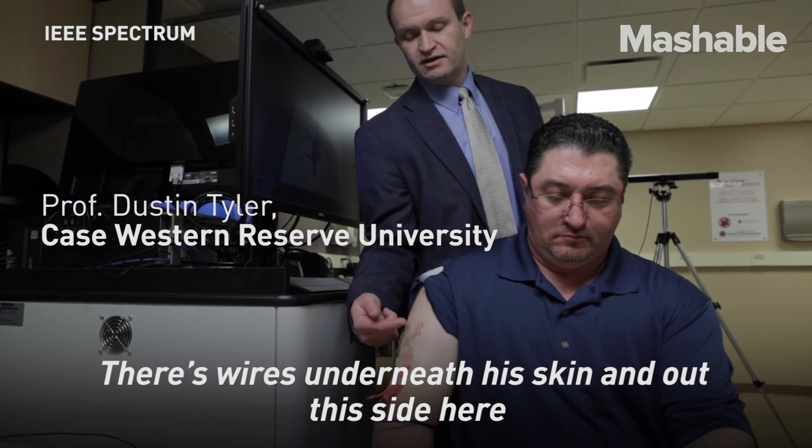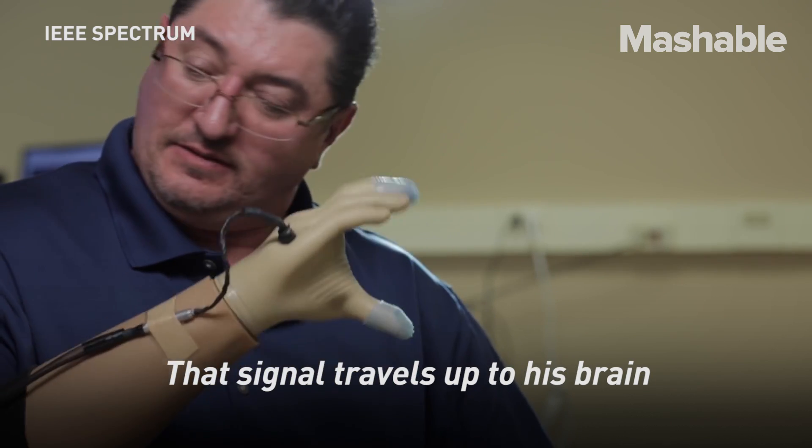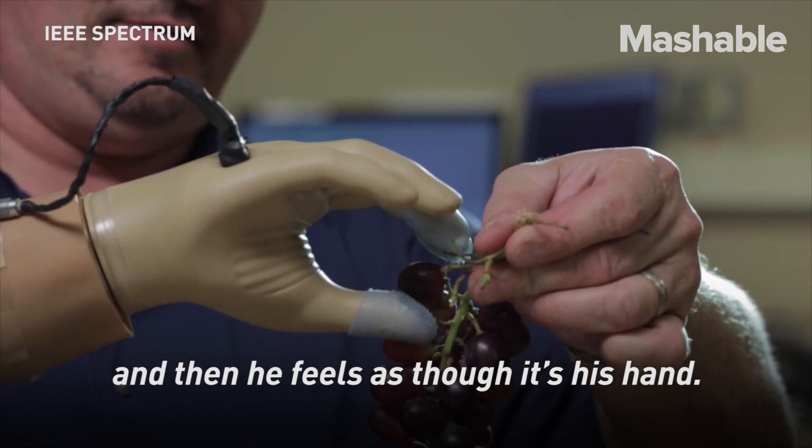There are wires that run underneath his skin and then out the site here that we can connect to an electrical stimulation system. That signal travels up to his brain and then he feels as though it's his hand.